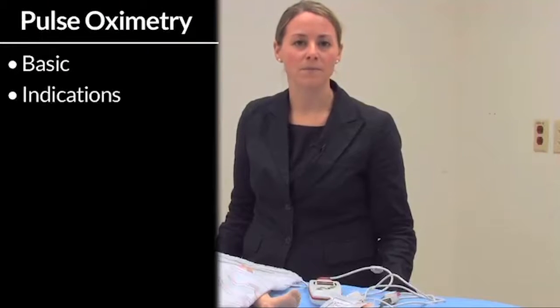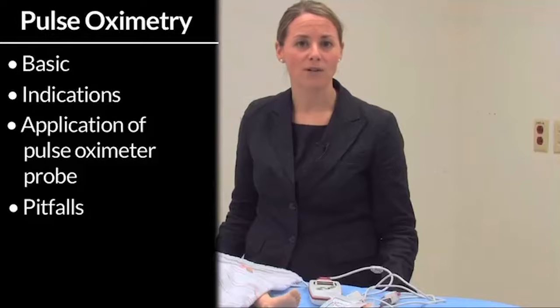In this video, I'll talk to you about basic pulse oximetry, some of the indications for using pulse oximetry. I'll show you how to apply a pulse oximeter probe, and we'll talk about some of the pitfalls of pulse oximetry.